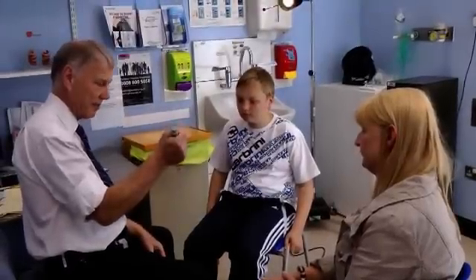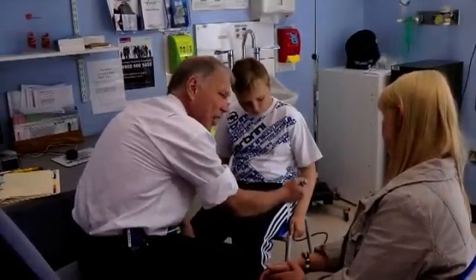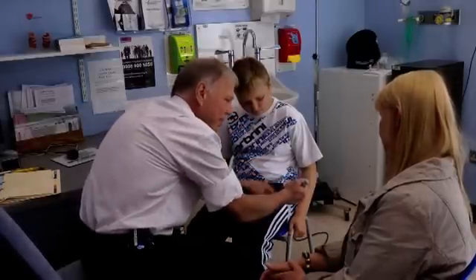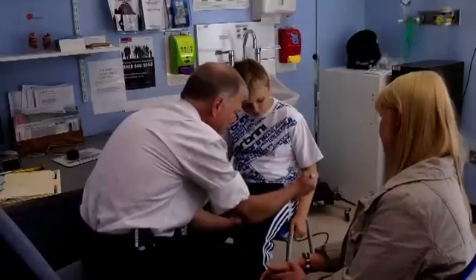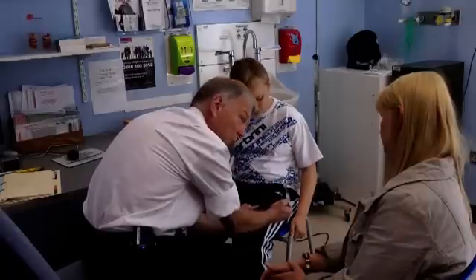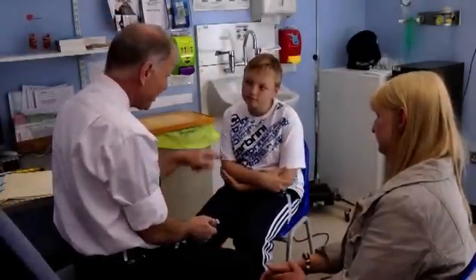It's the same approach: hold the EpiPen in a fist and hold it over the outer aspect of his thigh — on the outside, same position, halfway down, halfway around. Hold it in position, leave a gap, take the safety catch off. The only thing that's different is we stabilize his leg so his leg doesn't jump away. One elephant, two elephant, three, all the way up to 10.